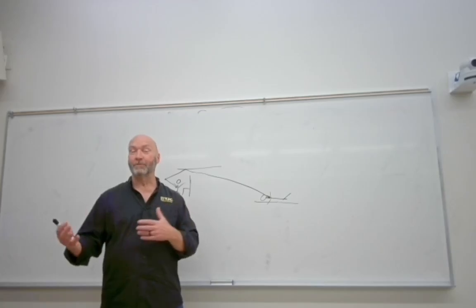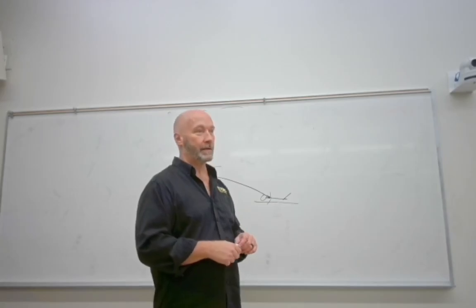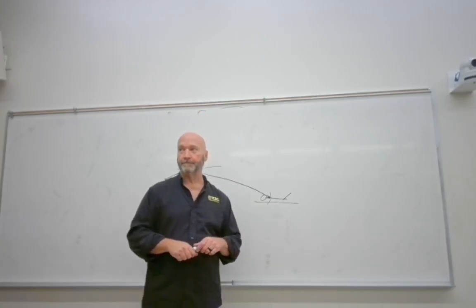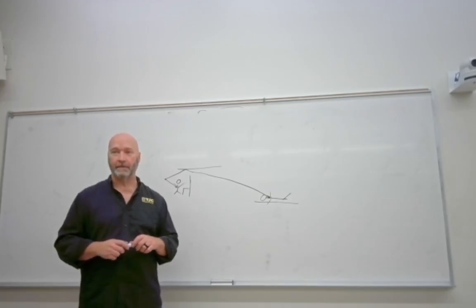So the protective housing limits leakage radiation. It doesn't stop all of it. 110 kVp penetrates a whole lot more than what I used to think.